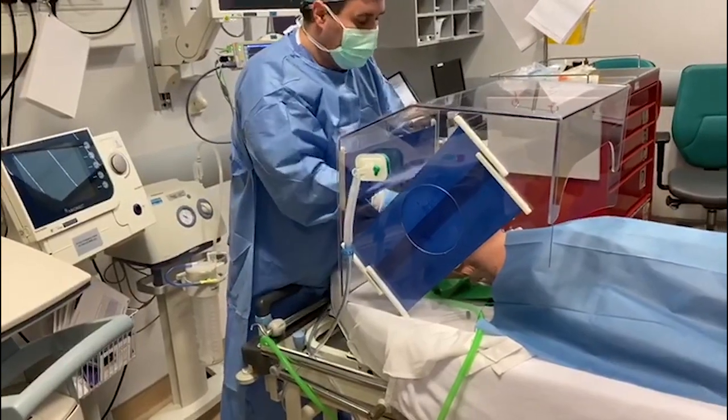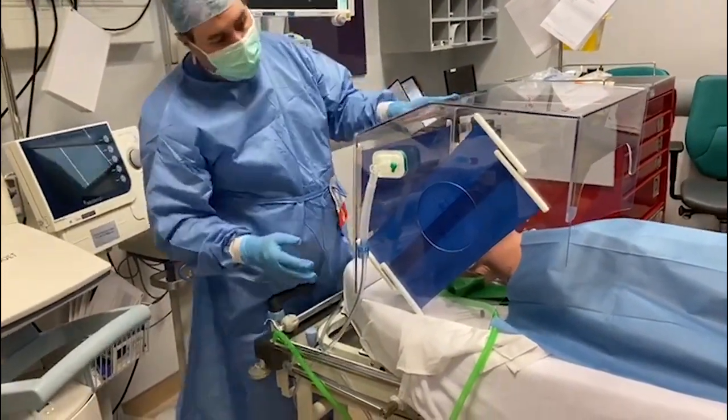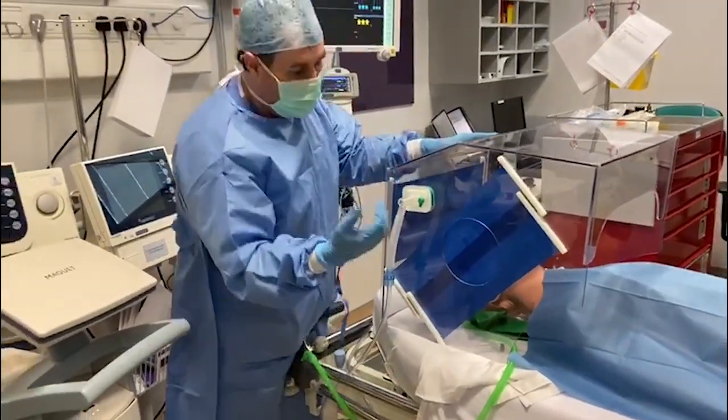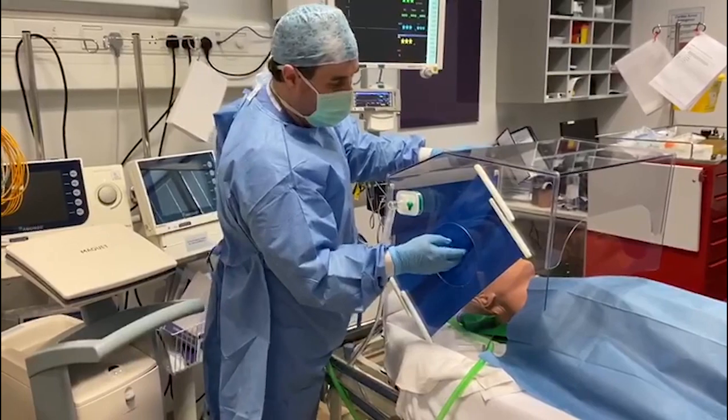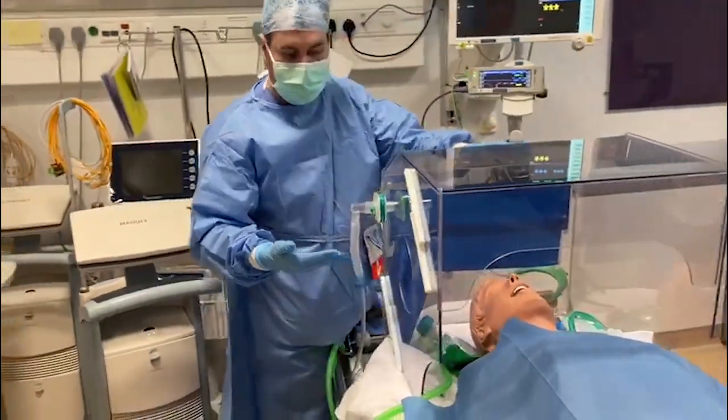We've got a really good view into the airway. We've put a hole for the assistant on the right-hand side, and we've got a cat-flap mechanism that self-seals on removing of the hand.